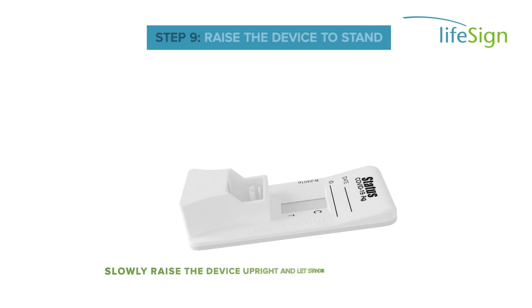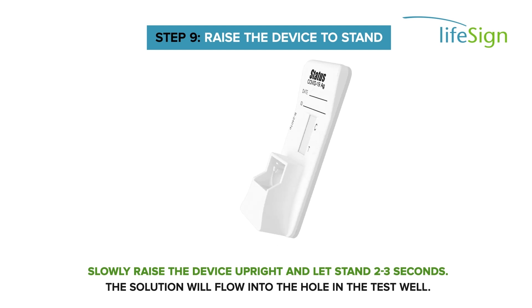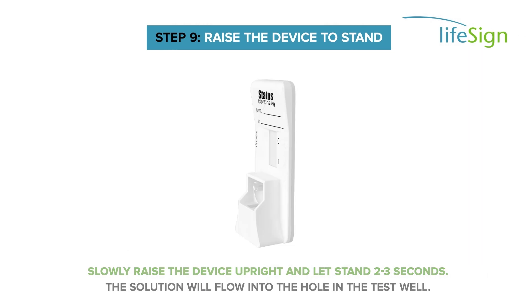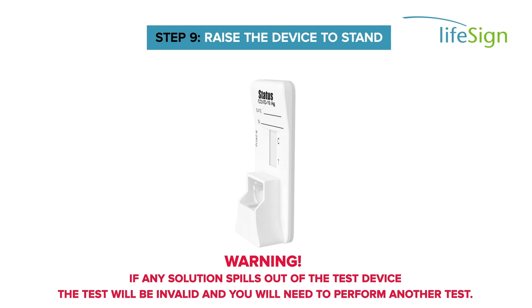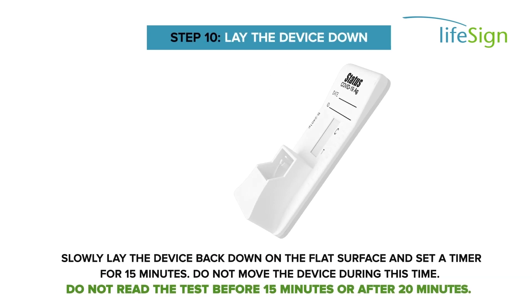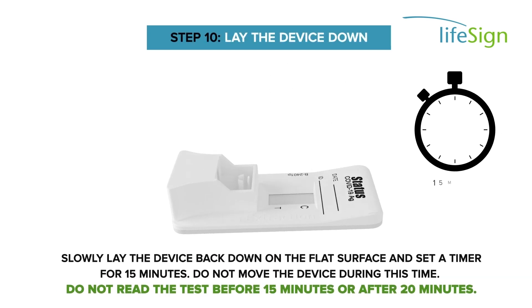Slowly raise the device upright and let stand two to three seconds. The solution will flow into the hole in the test well. Warning: if any solution spills out of the test device, the test will be invalid and you will need to perform another test. Slowly lay the device back down on the flat surface and set a timer for 15 minutes.